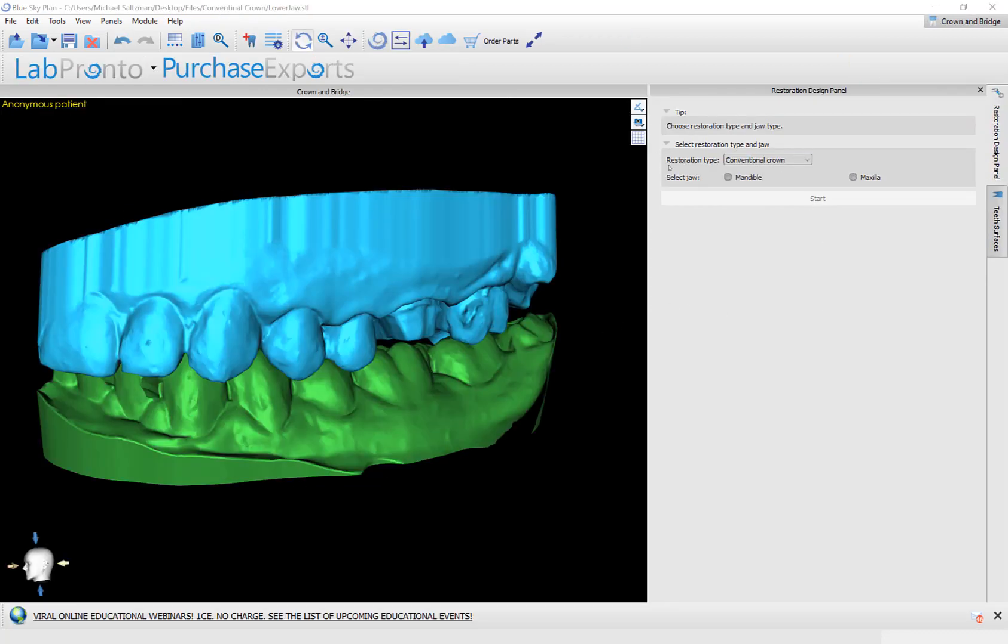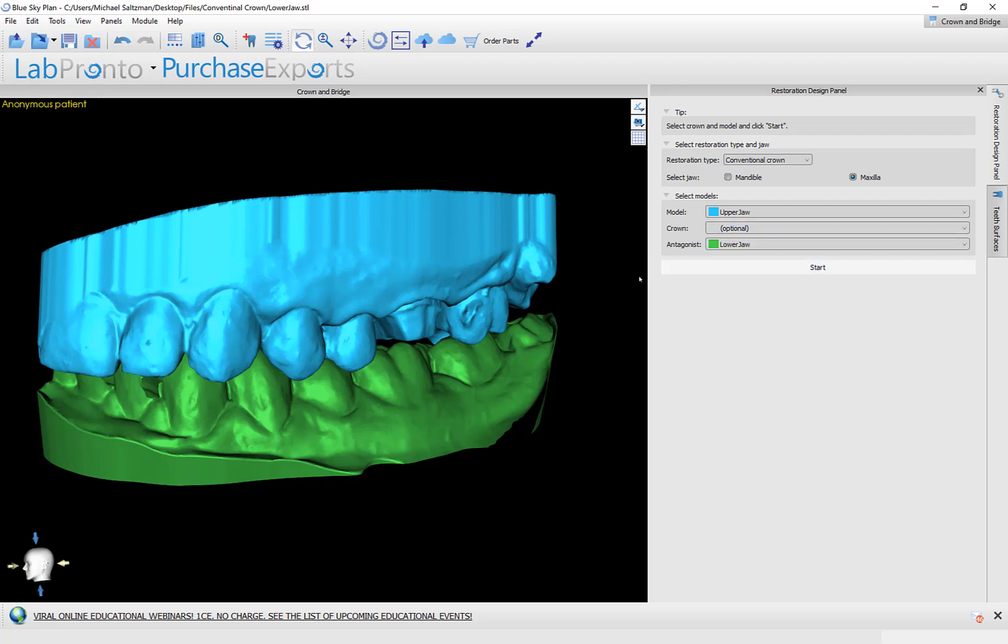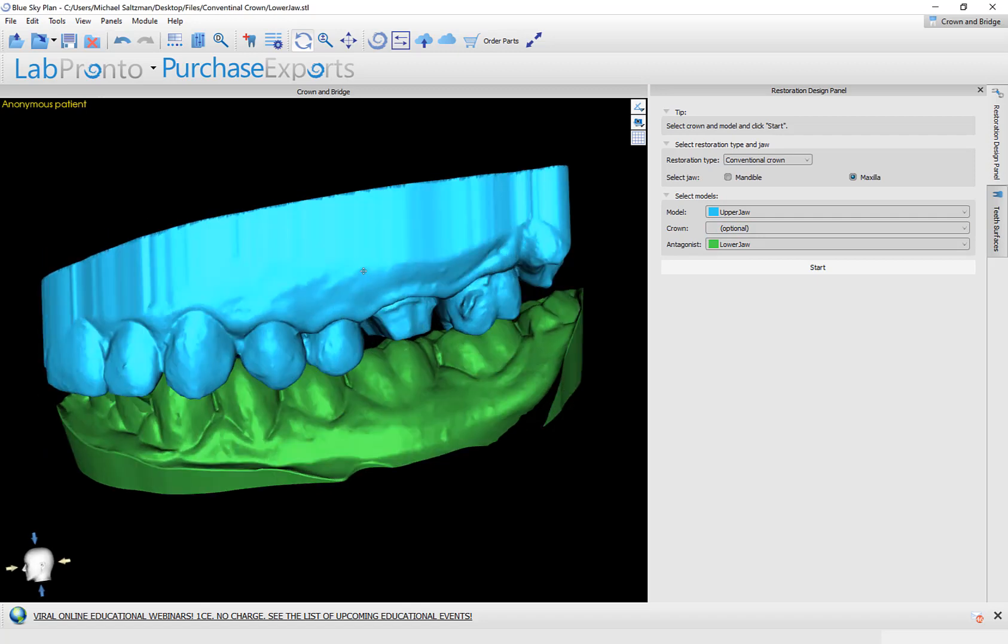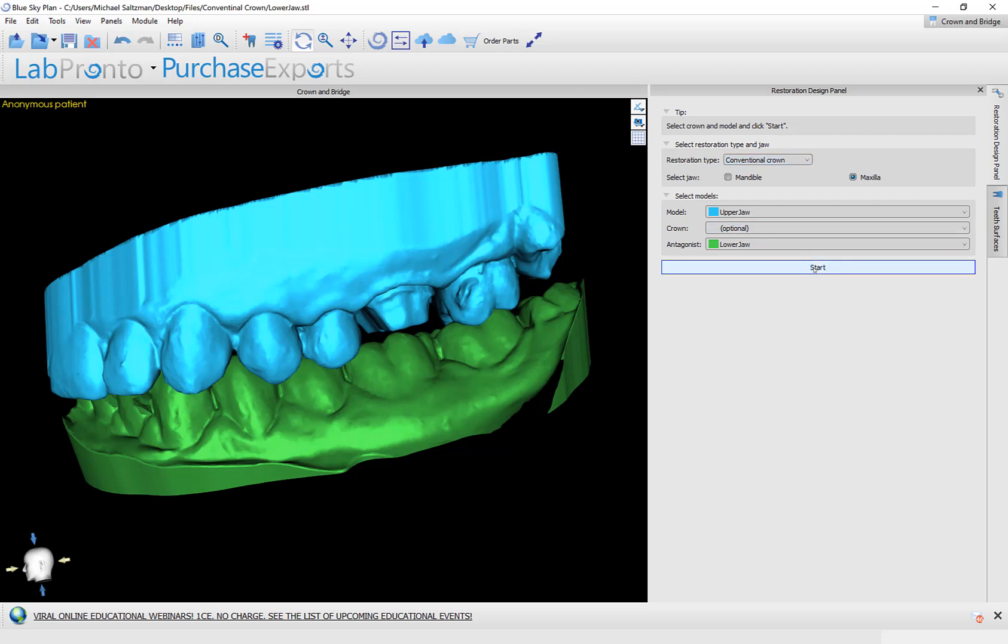On the right side of the screen, I'm going to select the restoration type, conventional crown, and I will select the relevant jaw. In our situation, that's a maxilla. In the drop-down menu, I'm going to confirm the selection of the relevant models. The model that we're dealing with is the upper jaw. The antagonist is the lower jaw. We do have multiple ways of creating the conventional crown. What I'm going to demonstrate now is the process flow where the crown should not be positioned prior to starting the process. But if you do want to place the crown manually, either in the previous step or in this step, then you could go ahead and do so and then select the crown from the drop-down list. But we'll demonstrate that in a different video. For now, I'm going to confirm the model selection. The model is the upper jaw. The antagonist is the lower jaw. We have maxilla selected correctly, conventional crown. We're good to go. So I'm going to press the start button.